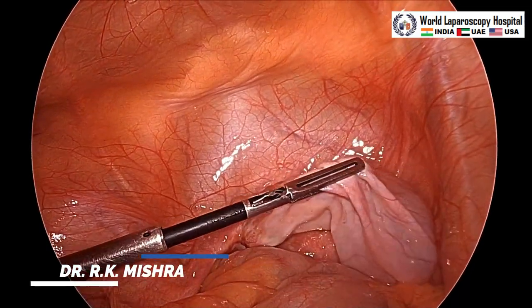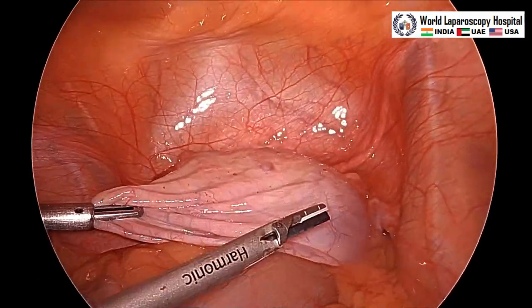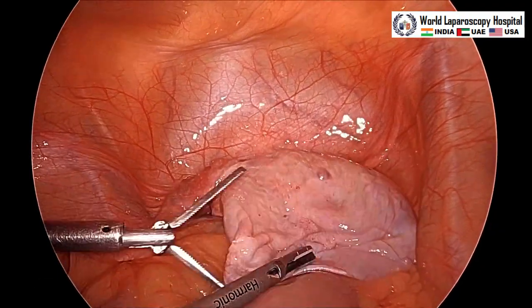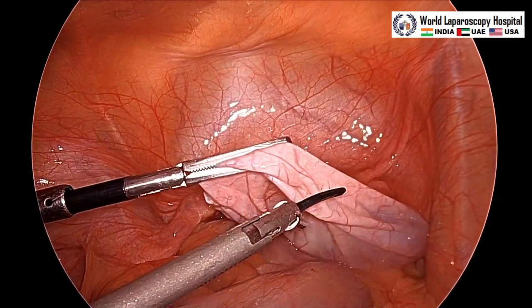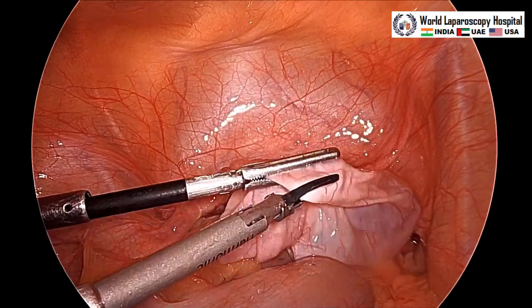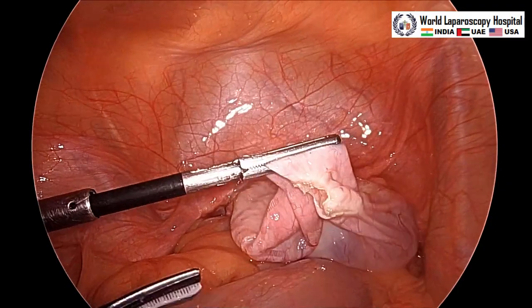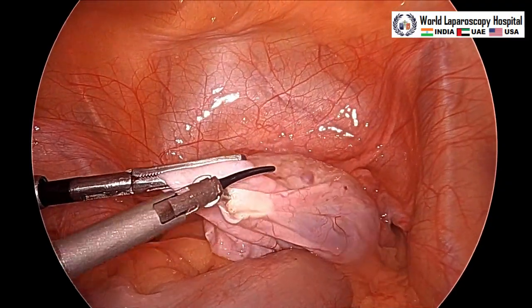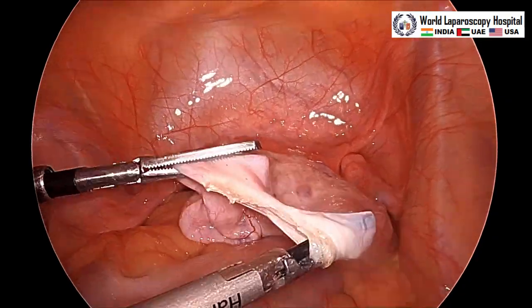After that we will hold the antimesovarian border — detorsion is done — and at the antimesovarian border of the cyst, with the harmonic a small incision will be given over the ovarian cortex. A little bit of tearing will be performed so that the cystic wall will be separately visible.